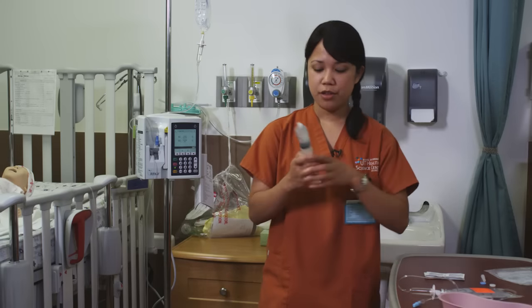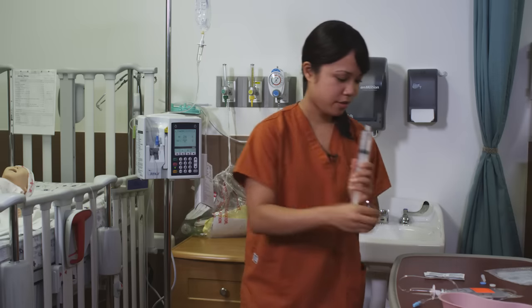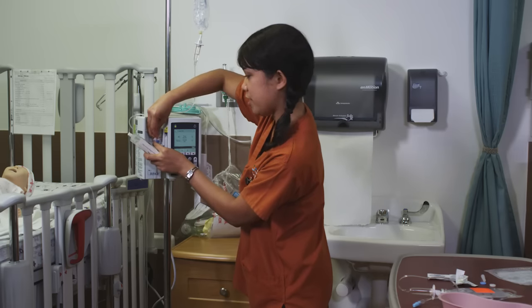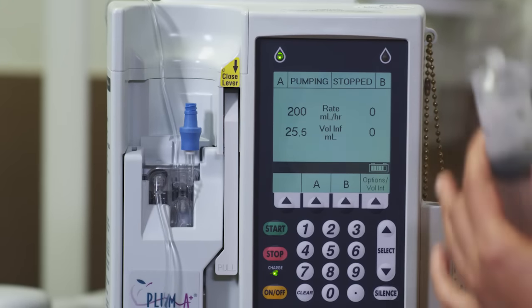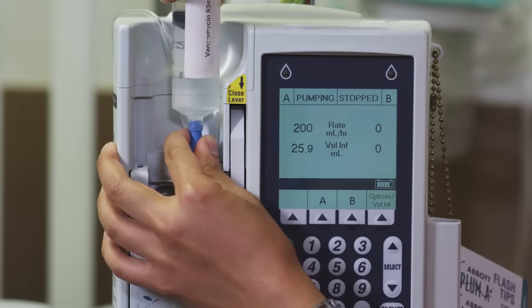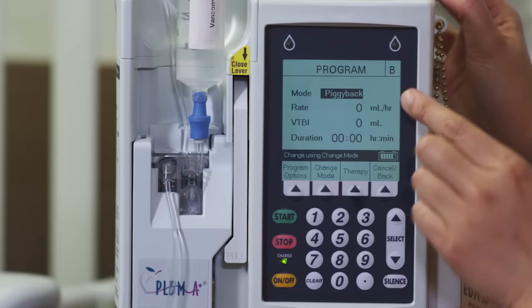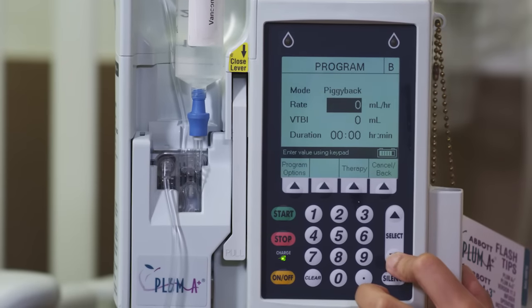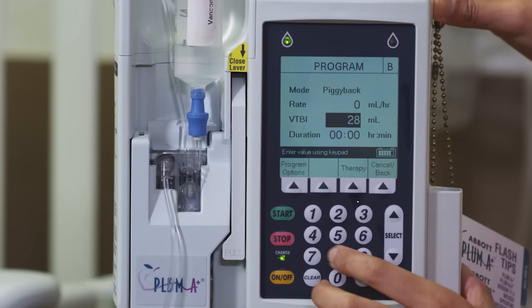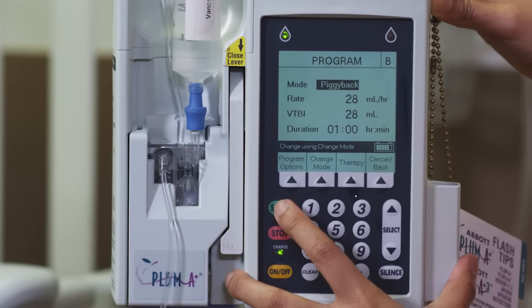Now let's connect the syringe to the pump. First make sure you have the right medication for the right patient and there's no air in there. Clean the hub — 15 seconds — keeping everything sterile. It just screws right in. Select channel B, because that's the secondary line, and it says piggyback. Go down to rate. This is vancomycin; volume to be infused is 28 mils, as indicated on the syringe. Vancomycin we give over an hour, so enter one hour and then start.